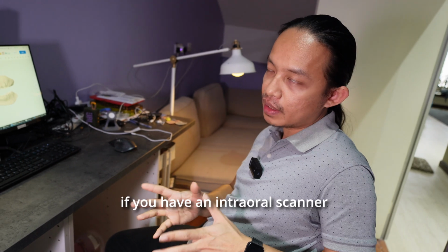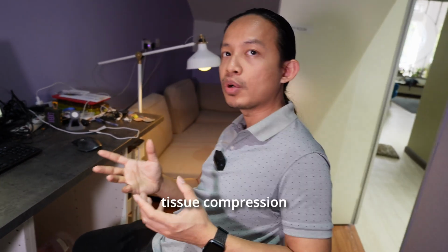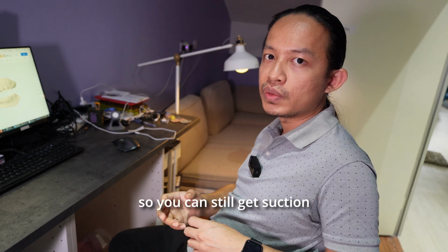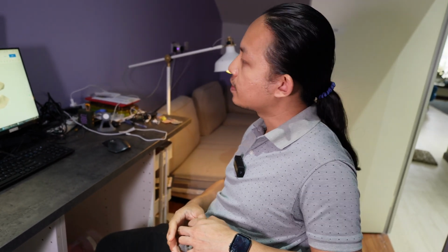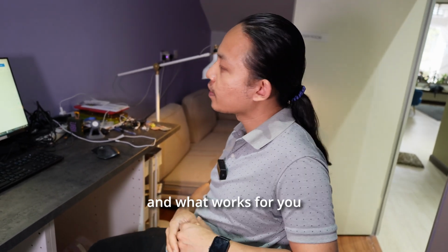If you have an intraoral scanner, one concern is you might not be able to get tissue compression. That might be a concern for some people, but in our experience, it works just fine. You can still get suction from the full denture. So in some cases, you don't even need to do a post-dam. It works fine, really. So you should try them, see what works for you.